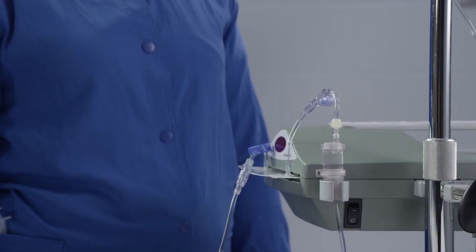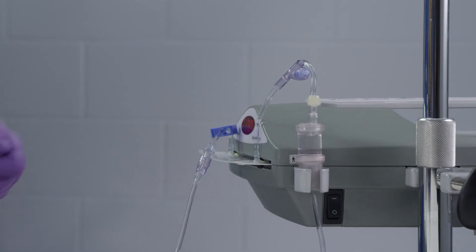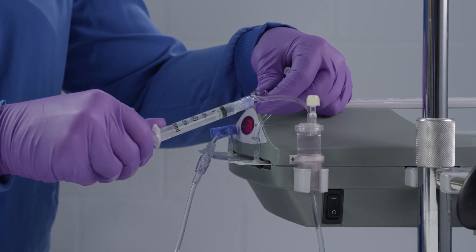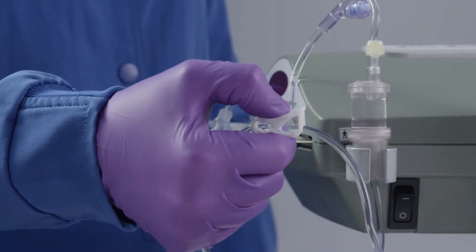To remove air from the disposable set, close the clamp between the air aspiration port and the patient connection. Insert a syringe in the air aspiration port and aspirate air until the bubble trap and IV line are free of air. Open the clamp and continue the infusion.